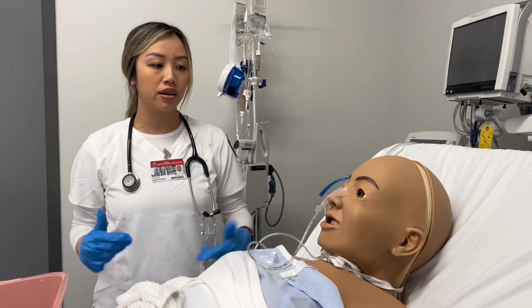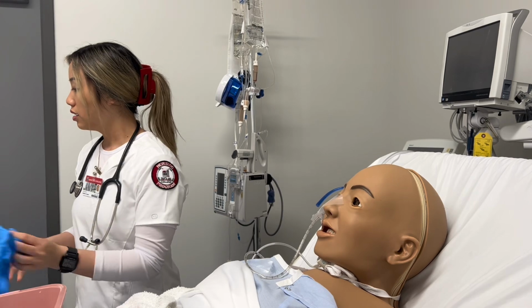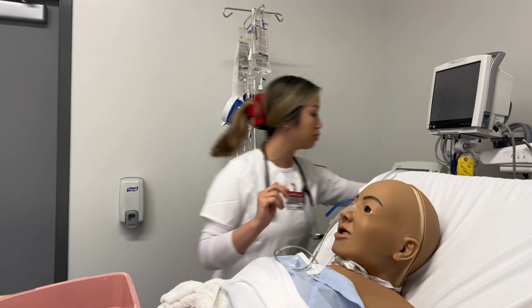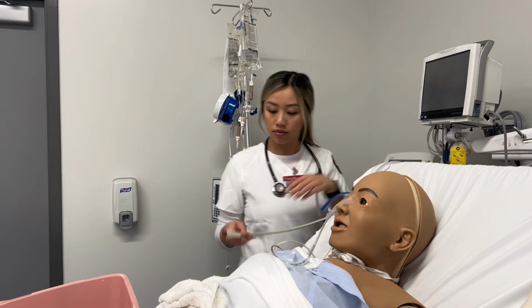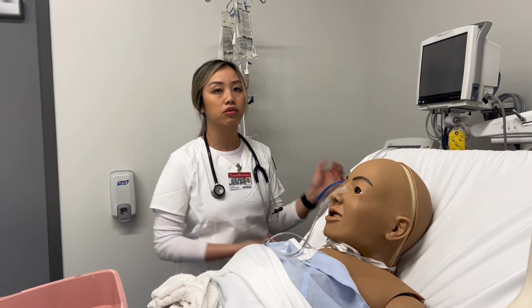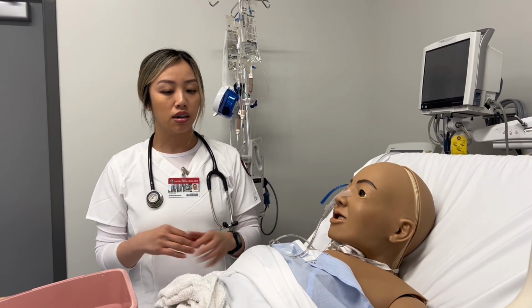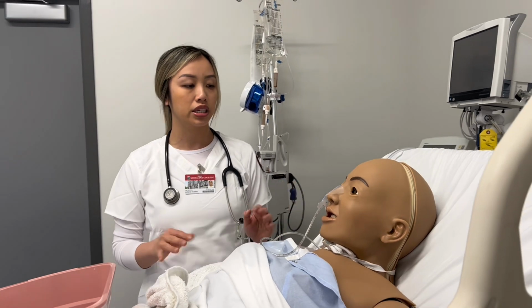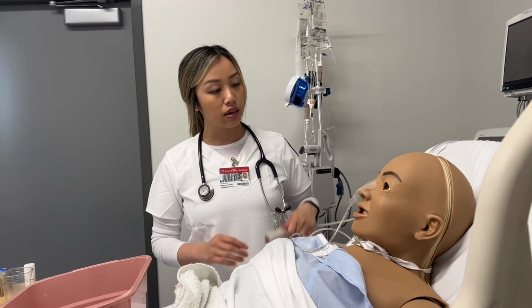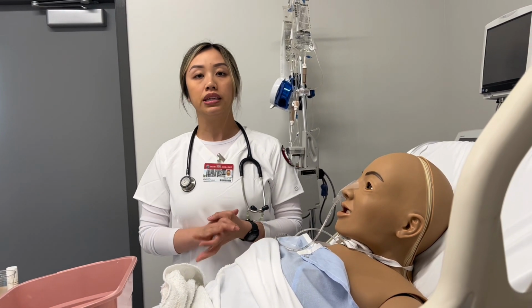And then at this time, I would go ahead and remove my gloves. I would go ahead and perform hand hygiene. I'll go ahead and put the call light in place. This hand here. And then I would put the rail up. I would put the patient back to a comfortable position. I would take the drape off and clean up my materials and just let the patient know if they need anything, just go ahead and press this call light and we'll be in shortly, okay? And then I would document everything.